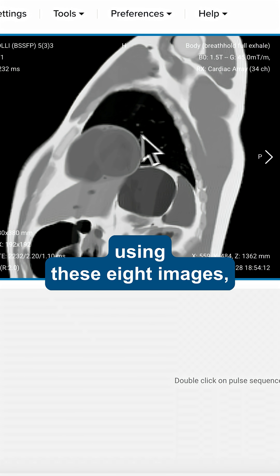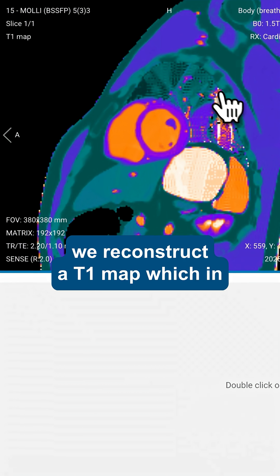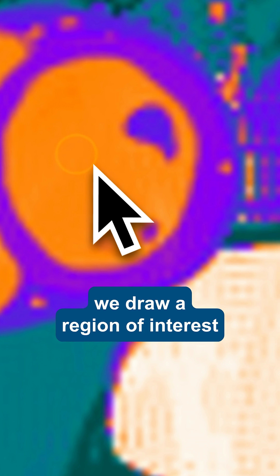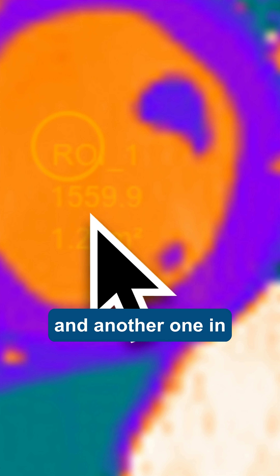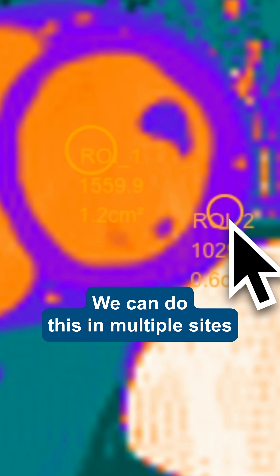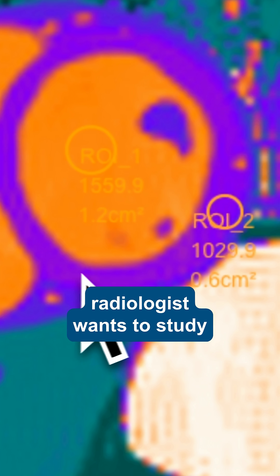Finally, using these eight images, we reconstruct a T1 map, which in clinical practice we show in a color-based fashion. Now to compute the extracellular volume values, we draw a region of interest in the blood pool to retrieve the T1 value, and another one in the myocardial tissue. We can do this in multiple sites according to what the radiologist wants to study.